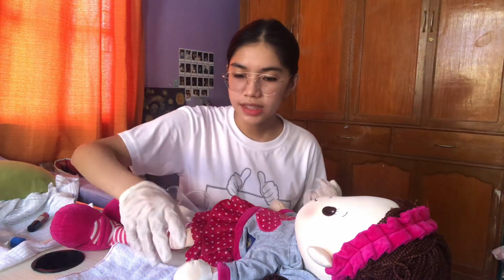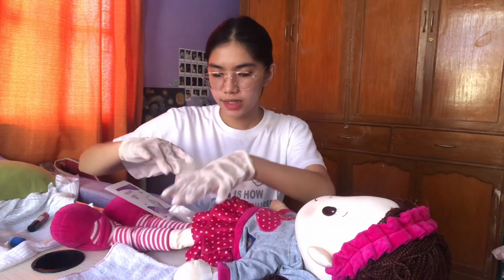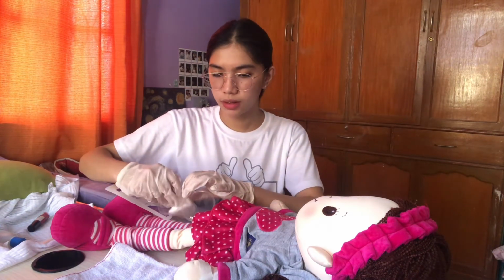Disconnect the used tubing. I'll be disconnecting the used tube, ma'am. Then I will place a sterile swab under the hub of the catheter. And then clamp the tubing, holding the hub of the catheter with non-dominant hand.